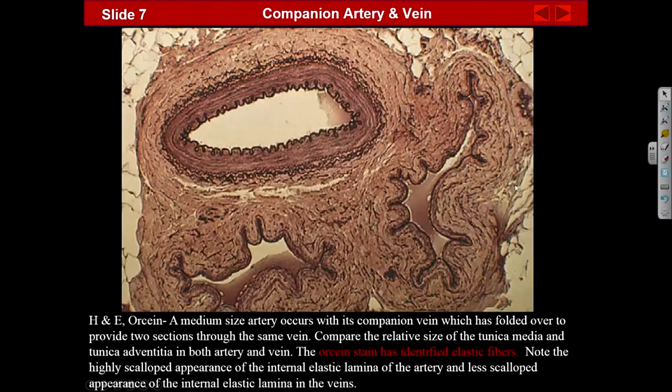Okay. And here's again 2 blood vessels, artery and vein companion, right? Again, I think now you can get the idea: the artery has the more open lumen, usually a more prominent internal elastic lamina. Media we can pick out quite clearly, whereas the vein, okay, we don't really see a media. Might be 1 or 2 cells of smooth muscle there. That's about it, because the adventitia is the thickest layer of veins. The lumen is collapsed. Here's this same blood vessel, probably looped over like this. Okay, any questions here? So we'll always look for the companion blood vessels.